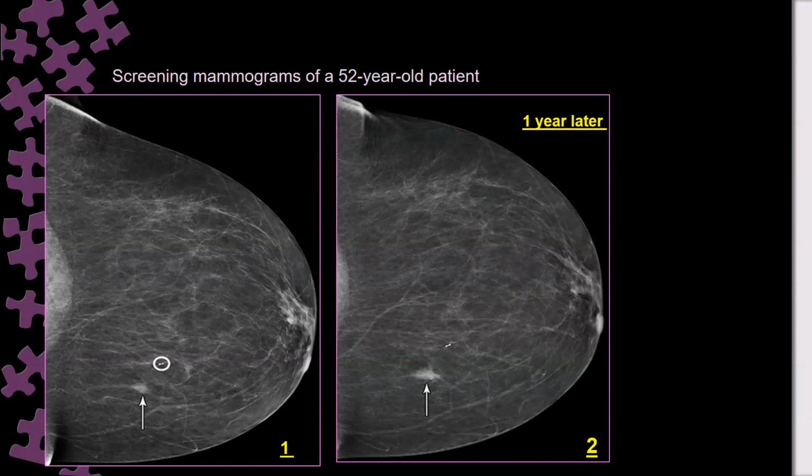No. Here, this is a screening mammogram. So this is a second round. I have to write here the second round of screening mammography. But if the patient is on treatment, here it will not be a screening mammogram. You have to look for the history. If this is a screening mammogram, this is the second round.